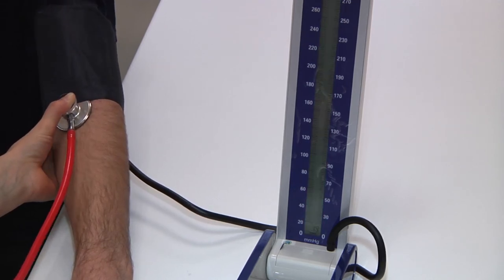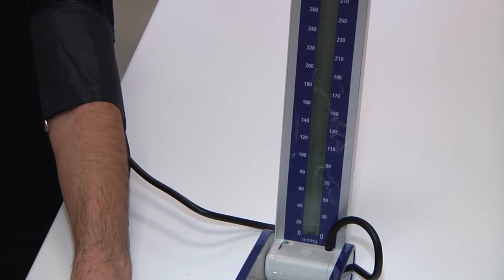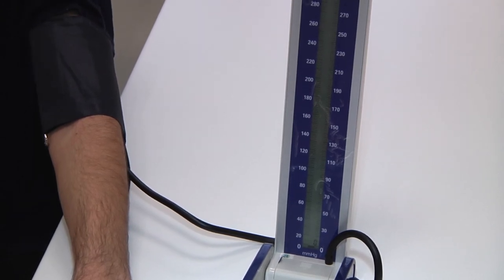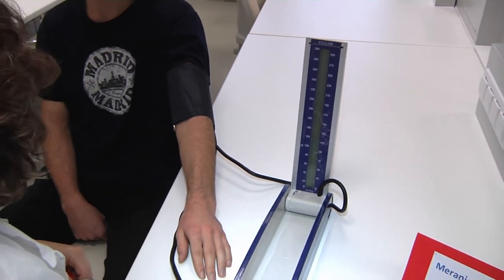The sounds disappeared when the cuff pressure was approximately 60, so we can say that the blood pressure is approximately 110 or 105 systolic blood pressure and diastolic blood pressure 60.